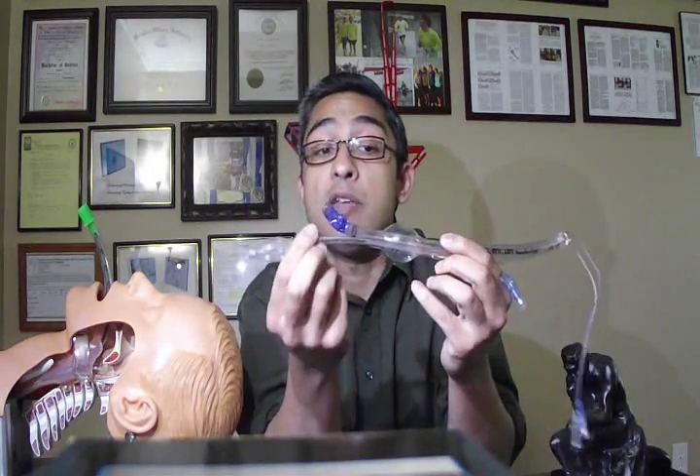The tubes are mobile relative to each other. This means that the length of the ventilation tube can be adjusted from 2 centimeters to about 14 centimeters. In the beginning stages of the procedure, the ventilator tube can extend right up to the carina. This creates a bigger space between the bronchoscope, which is housed just below the glottic opening, and the balloon, to be able to perform the tracheostomy without distending the trachea too much.